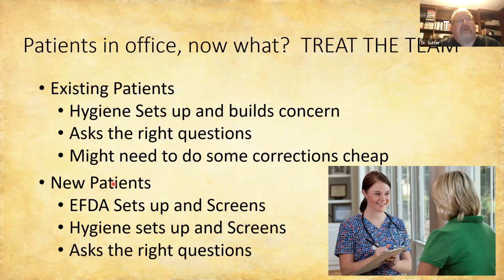Now it's like 80-20. What the hell's going on? Let's take a cone beam. Let's look at the joint, see if there's any changes. Have you had trauma? Are you a mouth breather? Are you sleeping on a CPAP? I mean, there's a number of things that I think would spark another conversation to follow up with that patient.